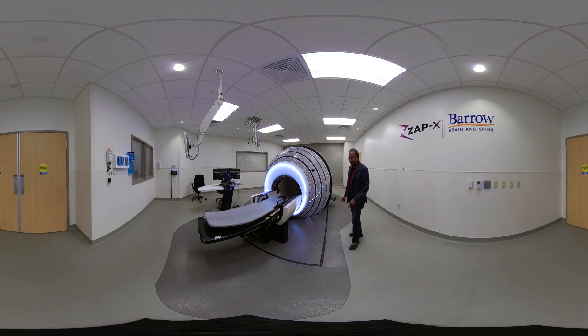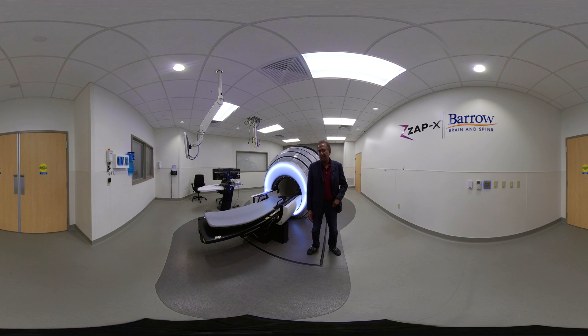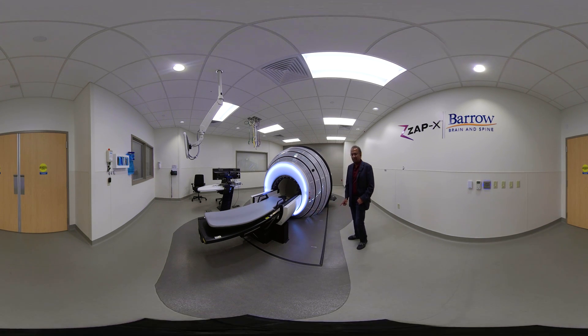Why is that important? Outside this dark area, the radiation levels when the machine is treating somebody are at public safety levels. Somebody without any radiation badge can be walking around here and it's completely safe. Almost all other radiation machines are typically in a radiation bunker, and outside that bunker there is enough radiation leakage that a public person cannot be walking around — only a radiation worker with a badge can stay outside. Here, inside the room, outside this dark area, the public can walk around. That is amazing.